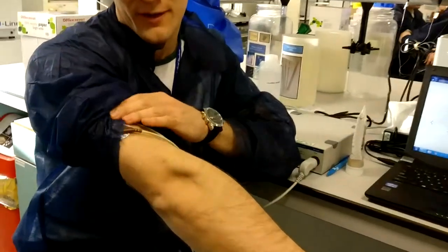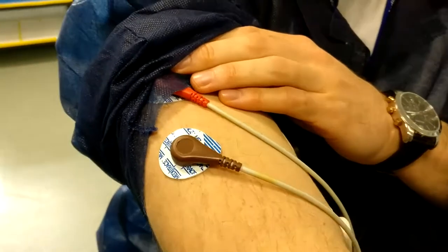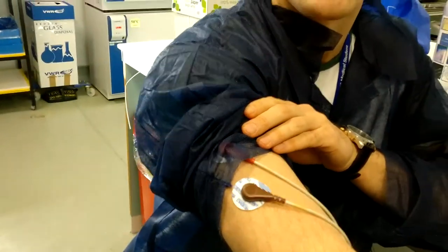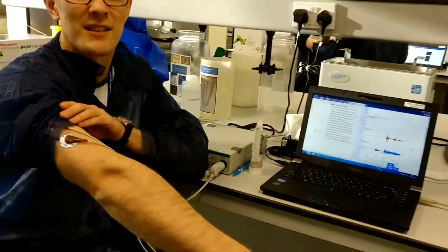I've got electrodes here, all on the muscles of my arm, bicep and tricep, and we're measuring electrical activity. The idea is that we're testing reflexes.